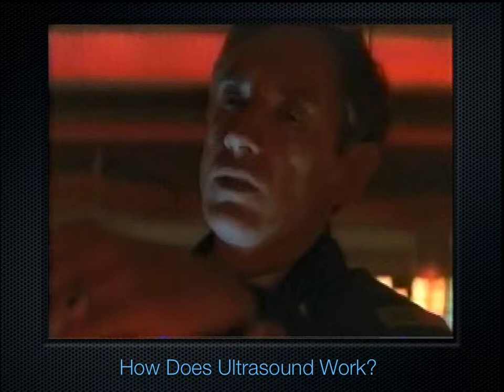And it turns out that the denser the structure, the brighter the dot, and the less dense the structure, the darker the dot. So bone is really dense, and so that's going to be really bright, really white. And the fluid-filled structures like the bladder or the gallbladder or free-flowing blood are not dense, and so that's going to be black on ultrasound.